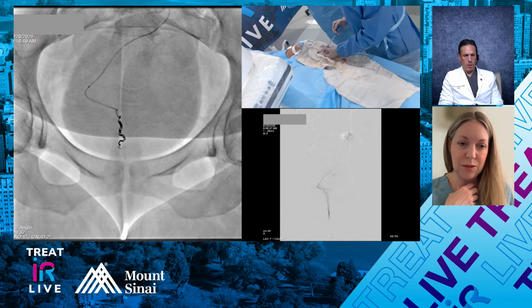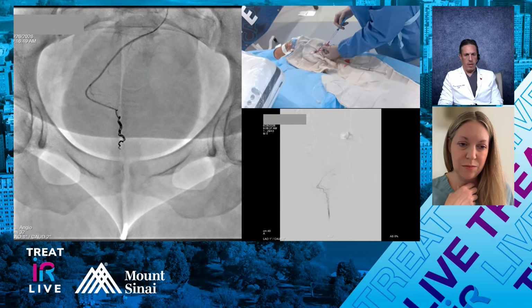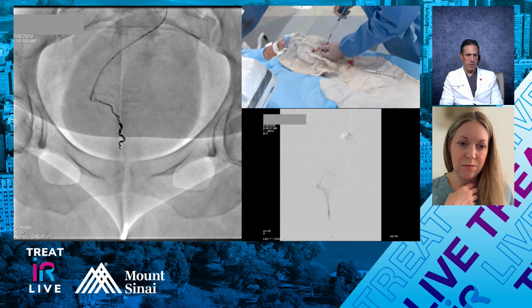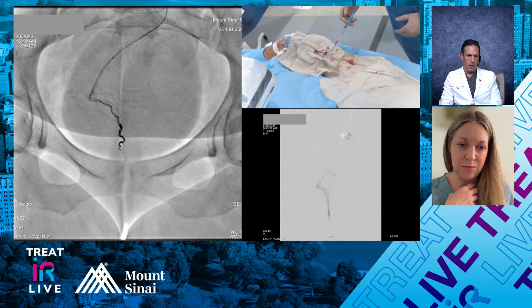You guys want to talk a little bit about how many vessels you think we need to embolize in these cases? This is a great example of where we see the blush, but there are obviously other rectals that are going to feed this. Do we base this on what the angiogram looks like after we embolize each one, or are we going to just do all the different rectals that we see on the angio, regardless of whether we see blush? What do you think about that, Jesse?